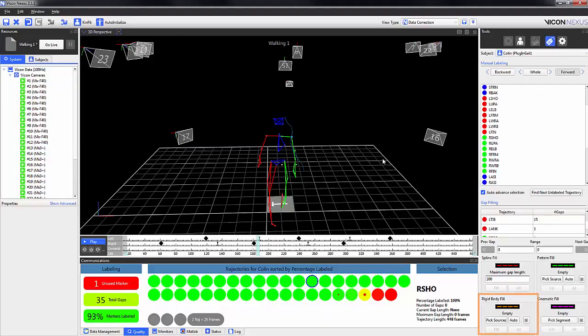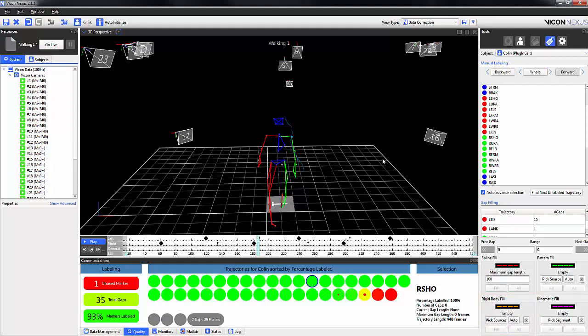The orange is the rigid body fill. In order to use this, you need a minimum of 4 trajectories on the segment. This is because if you lose one marker from a cluster of 4, you can still recreate a plane from the 3 remaining trajectories. As the head segment is made up of 4 markers and one is missing, I can use the remaining 3 trajectories on the head to recreate the missing marker by using the rigid body fill.